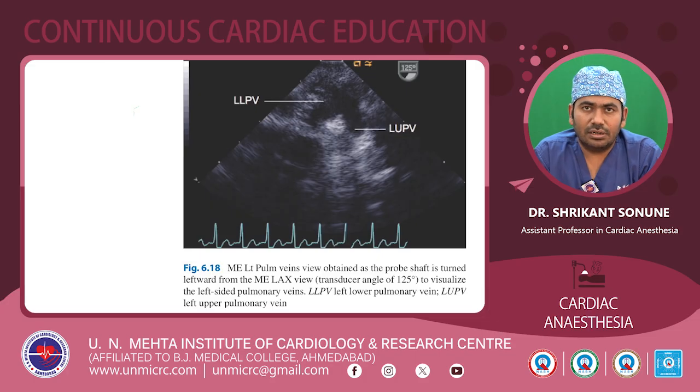This is the classical formation of an inverted V which can be seen, and if you put a color flow mapping, then the flow of both the upper and lower pulmonic veins can be seen just opening in the left atrium at this side.